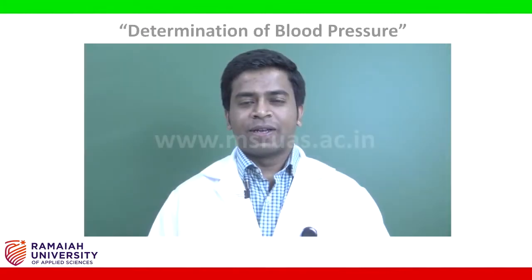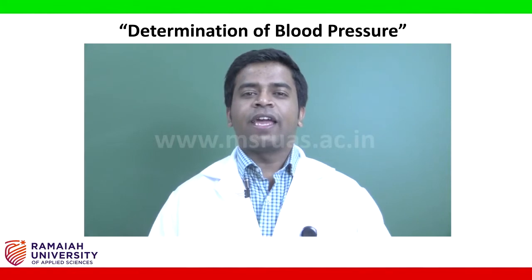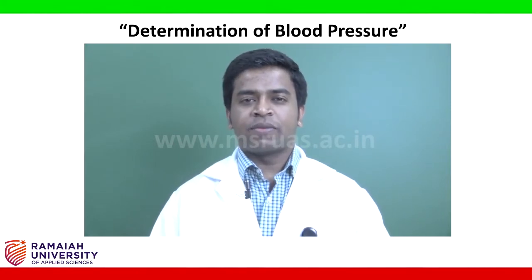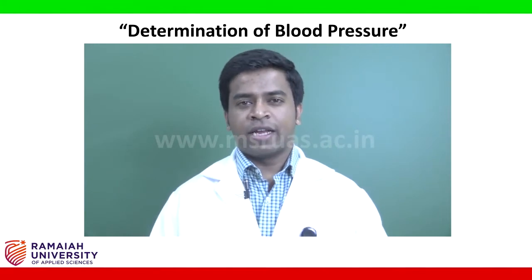Hi students, today we are going to study determination of blood pressure. The aim of this experiment is to determine systolic and diastolic blood pressure and in turn calculate mean arterial blood pressure, and also to observe the effect of exercise on blood pressure.